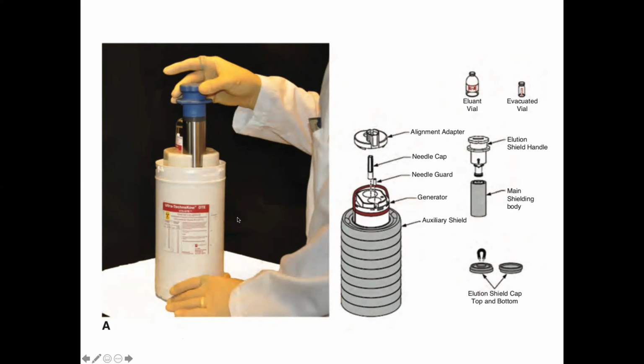The stuff that's in here that's decaying into your contrast agent normally has a much longer half-life than the contrast agent you stick in the patient. You want the contrast agent that goes in the patient to have a short-ish half-life, so that they're not exposed to radiation over a long time. You just want the radiation while you're imaging, and then you would like it to be gone as soon as possible.